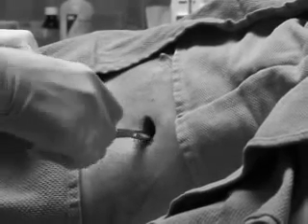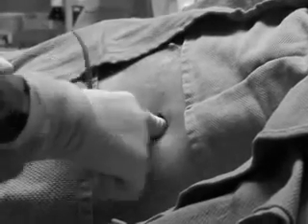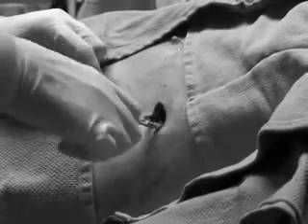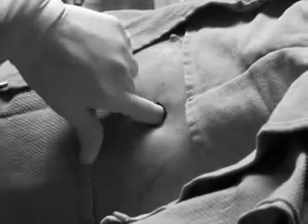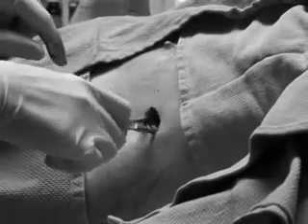When using a larger chest tube of sizes 24 French or greater, use your index finger to explore the tract being created by blunt dissection. This is done to ensure the larger caliber tube will be able to pass through the tract. Once you have dissected through the subcutaneous tissues and deeper intercostal muscle layers, you will encounter the parietal pleura.